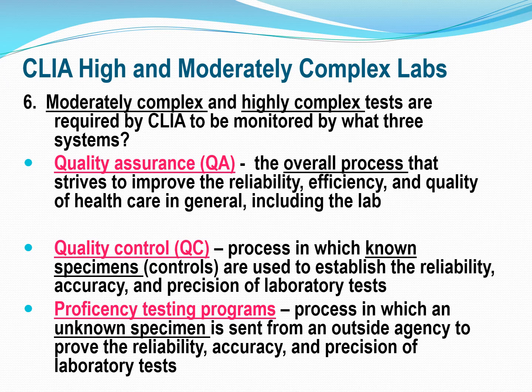If you're working in a doctor's office where you do a lot of glucoses all day, every day, when you come in that morning, you will run your controls. You run two levels of control, let's say a normal and a high. You're going to record those results and make sure that they come in within range. That tells you that your machine is working correctly. It helps us to establish, and we'll learn the differences with these, reliability, accuracy, and precision. Laboratory tests need to have all three of those things, and these known controls help us to establish that.